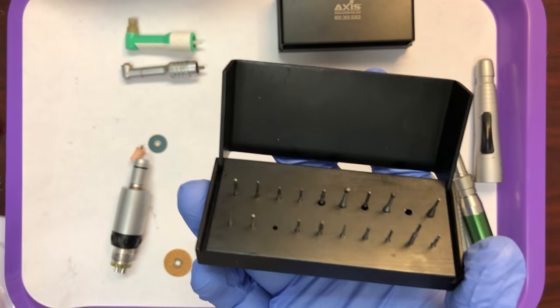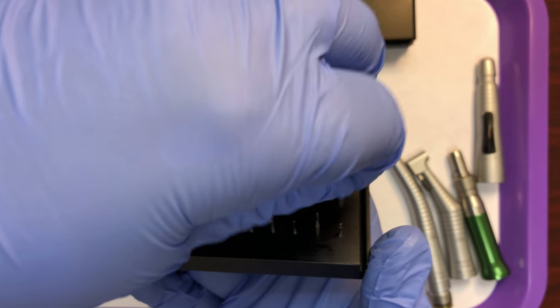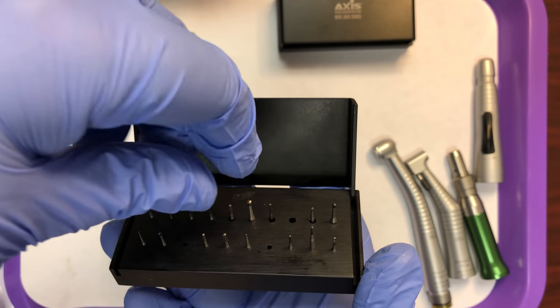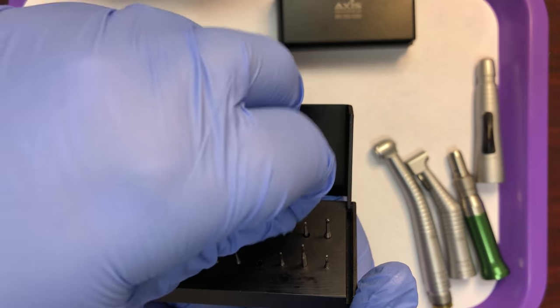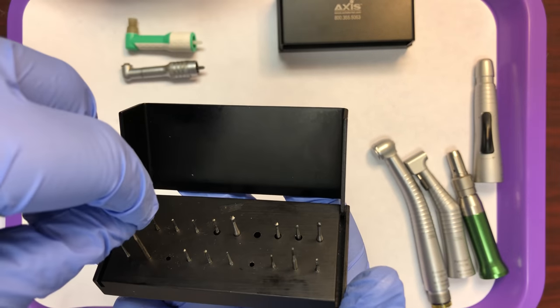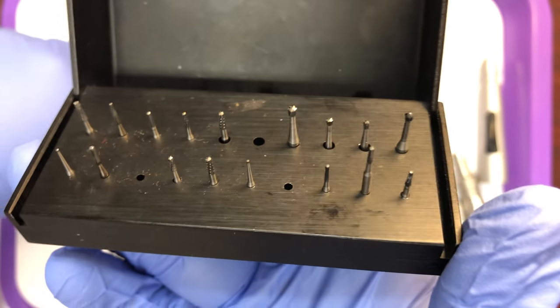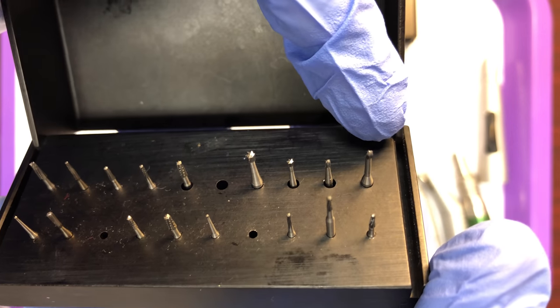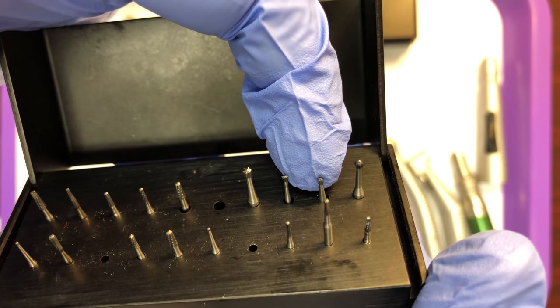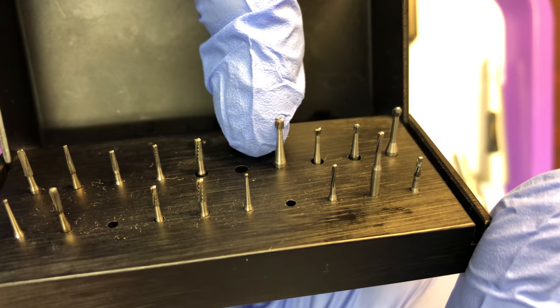I'm going to arrange these for comparison: round, pear, inverted cone, and another inverted cone. So in the back we have a round burr, a pear, an inverted cone, and another inverted cone.